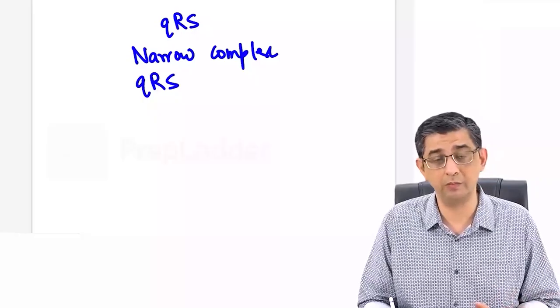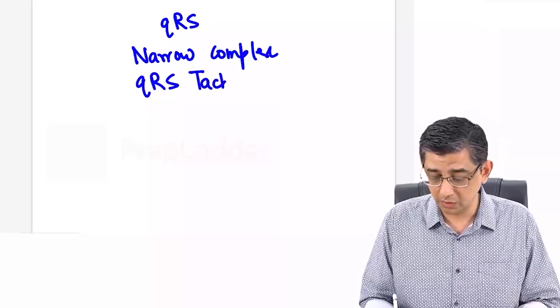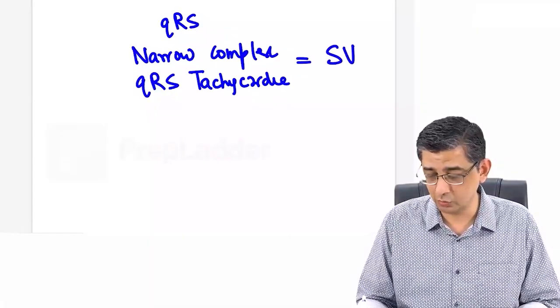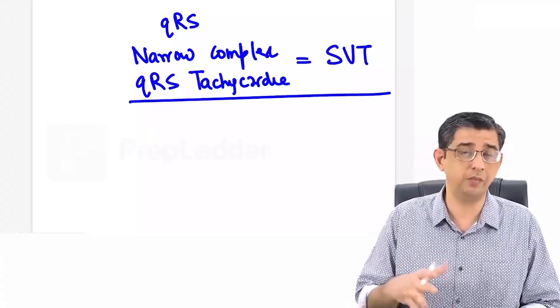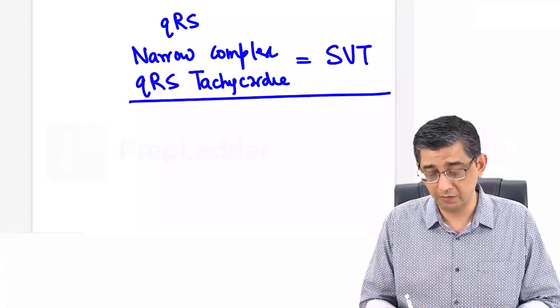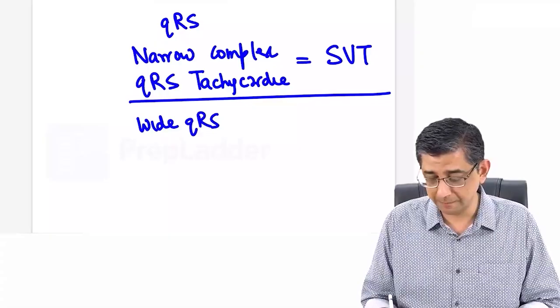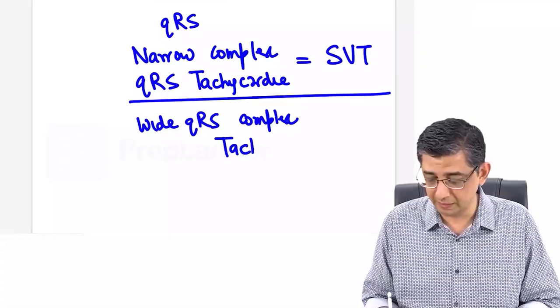For example, we talked about broad QRS even in third degree heart block. So when I say narrow QRS complex tachycardia is present in a patient, it always signifies SVT, supraventricular tachycardia. I'll be describing various varieties of it like atrial fibrillation, atrial flutter, PSVT. Whereas whenever you read about wide QRS complex tachycardia, in those circumstances, it will always imply a VT.